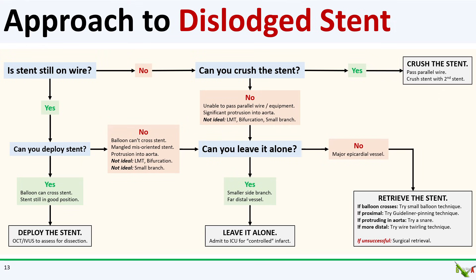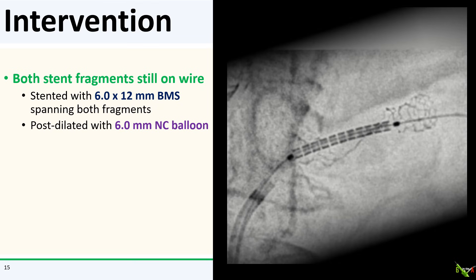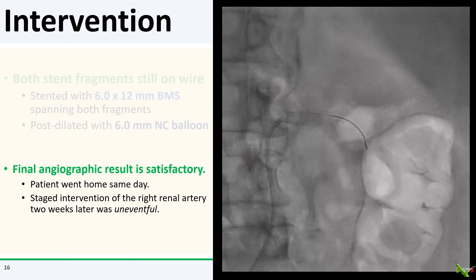So there is now a fractured, dislodged stent in the renal artery — what to do? We can look at our algorithm for dislodged stents. I have a full video on this for anyone who is interested, and I will provide the link in the comment section below. In this case, it's thankfully straightforward: both stent fragments are still on the wire, and another stent can simply be deployed inside the two stent fragments. A 6.0 by 12 stent was deployed in the renal artery spanning both fragments, and post-dilated at very high pressure with a 6.0 non-compliant balloon.